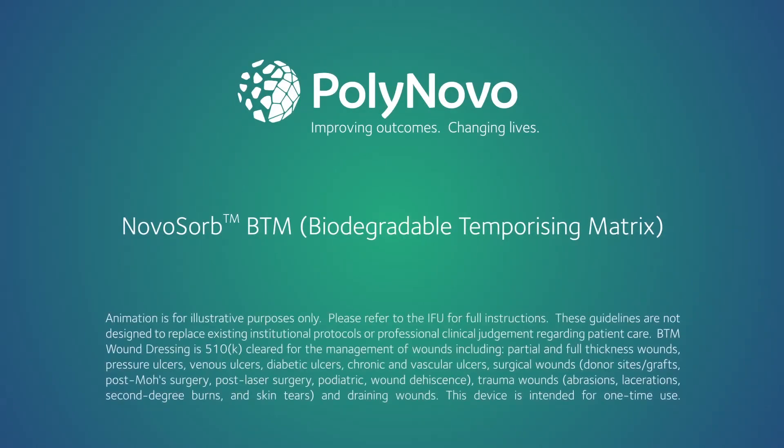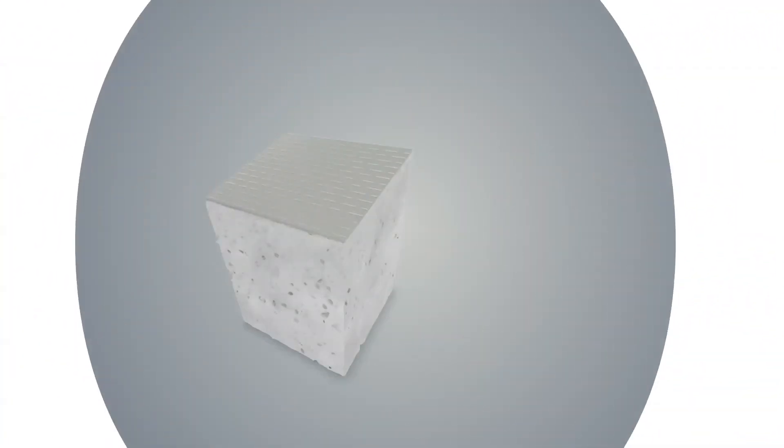Novosorb BTM, a biocompatible and biodegradable polyurethane matrix, is composed of three layers.